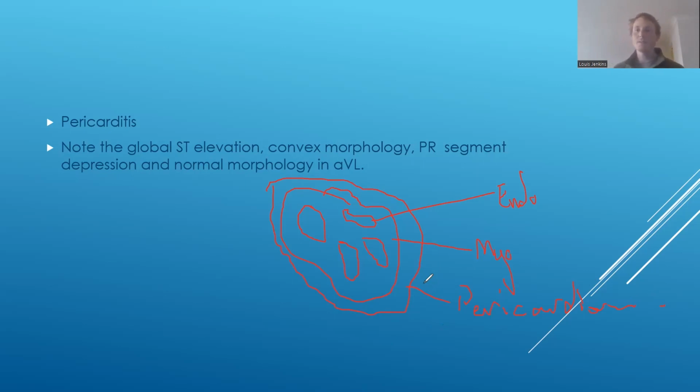And it can be associated with ECG changes as well, depending on the stage of progression of disease. Those ECG changes are kind of what we're talking about here, and it's what's going on with this patient. Now, the question is, do you take this patient to a cath lab or not?